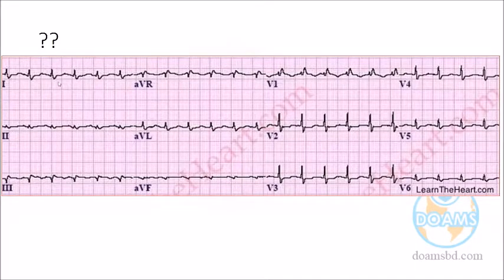And in the limb leads, doctor, is there any more than 5? Any more than 5? Yes. Where? In which lead? AVL. No, more than 5, doctor? No, 5, doctor. Exactly 5, maybe. Exactly or less than 5. Colleagues, helping us, doctor? Better 3 people together to decide. No one. Be active, please, doctor. So it is also less than 5. This is also less than 10. So better to say something different.